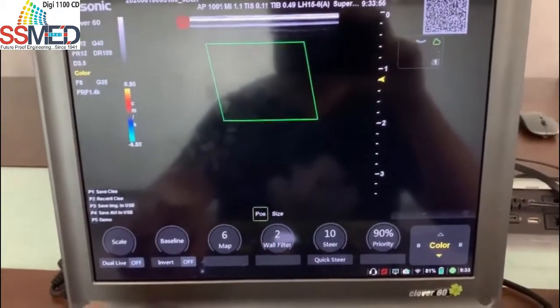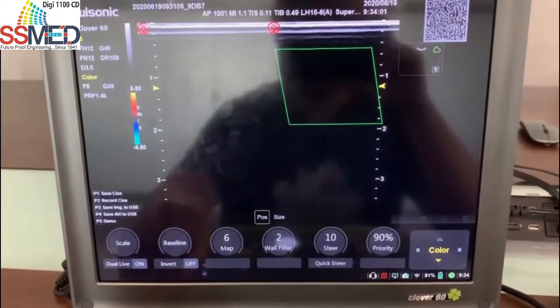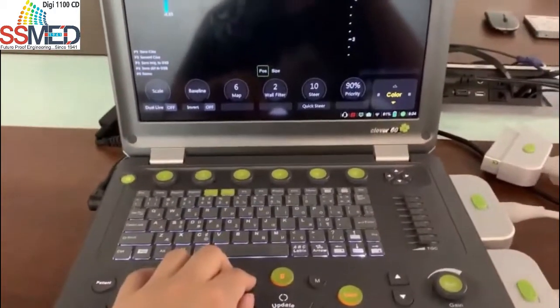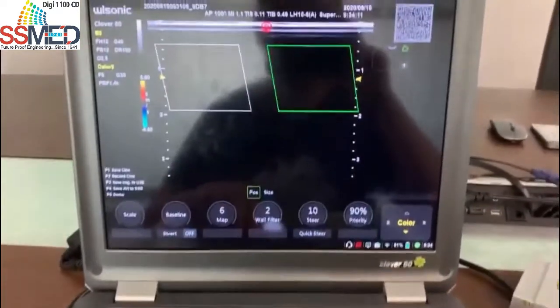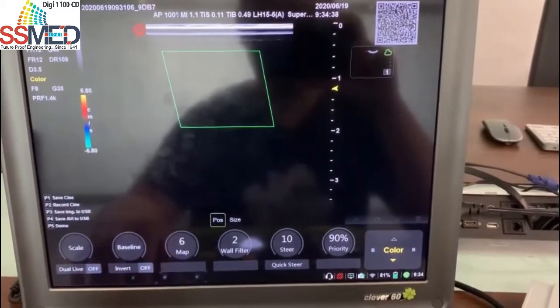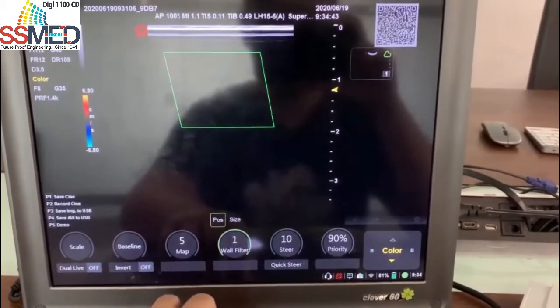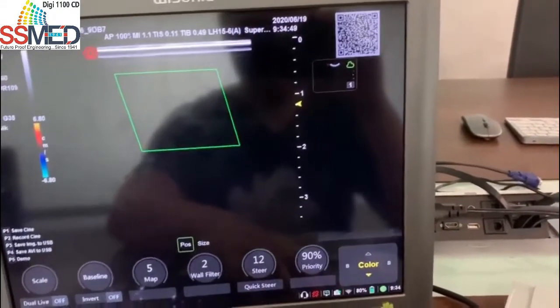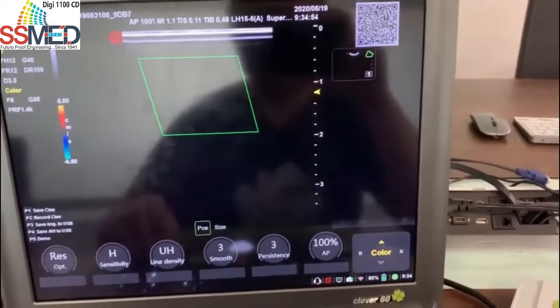Let me show it. For the color mode, we have the dual live, that is actually the dual image, that is the same thing. Here we have the map of color, and the steer angle of the sample gate. Of course, for another page, we also have some more options for the color.